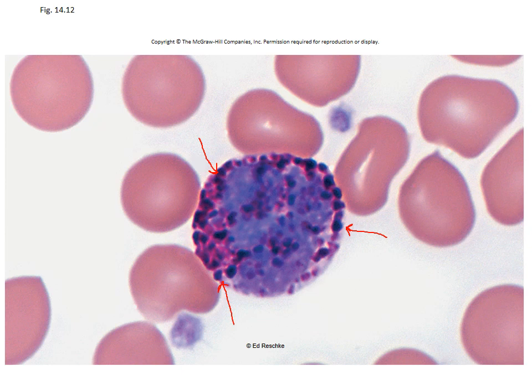Now, I do want you to know there are 2 types of granules here. The first one, or one of the types, has something called histamine in it.